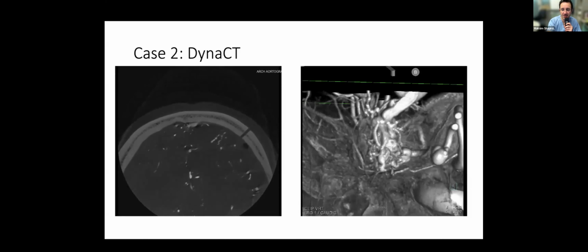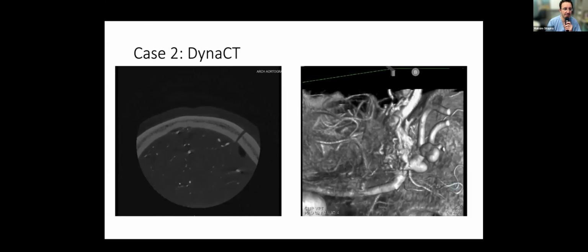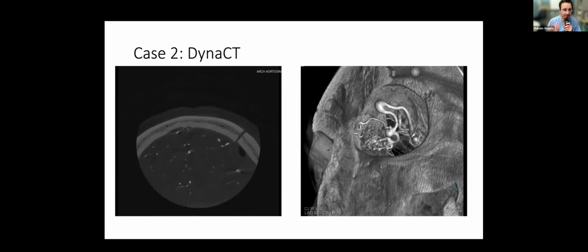But speaking of the ophthalmic artery, it's interesting. The other thing that's interesting in this case is obviously there's a lot of difficulty because of how the ophthalmic comes off, right? The angle doesn't look great. You have difficulty in catheterization, which should be acknowledged. We push for treatments transophthalmic, but look, it can be difficult in experienced hands. And in the end, you lose the ophthalmic artery, right? I assume to thrombosis or dissection or something. Yet the patient maintains vision, right? You said that vision was not lost.